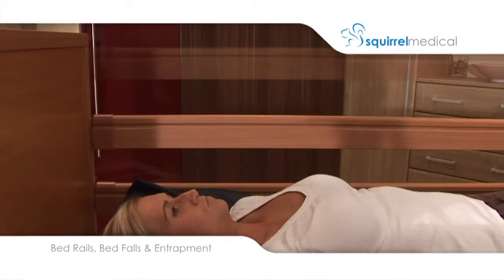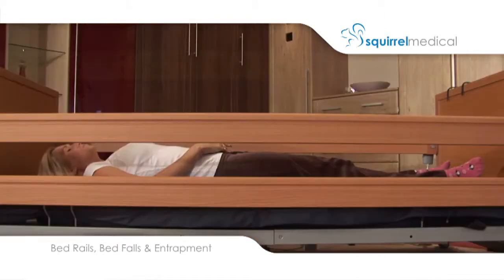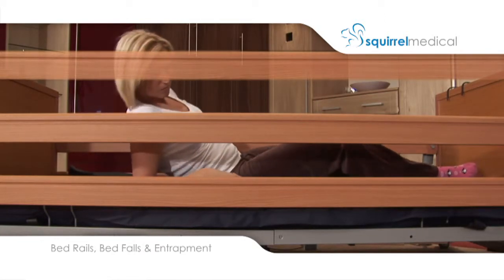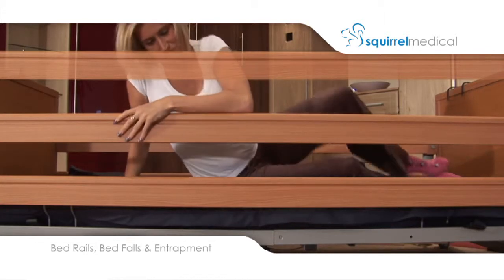Some people have attempted to fit retrospective extensions in order to increase the height of the original bed rails. The problem here is that the higher the rail from the floor, the further one has to fall. Anyone who has seen the results of a bed fall to an elderly, fragile patient will understand the implications of their use.